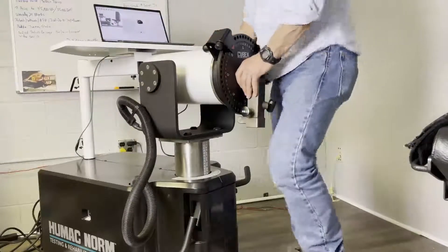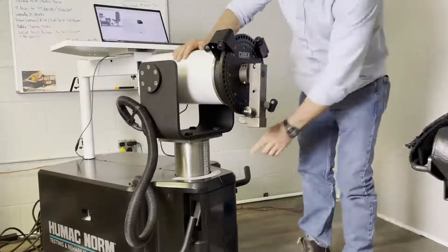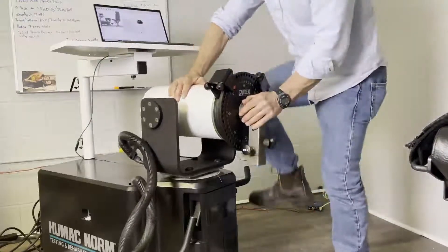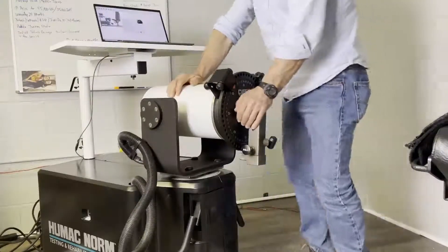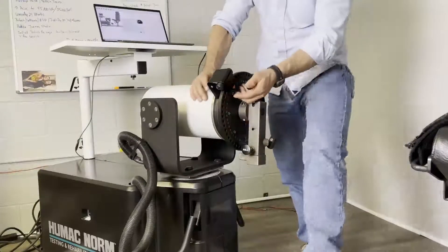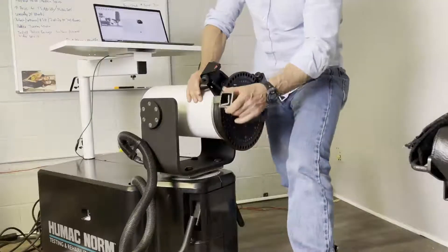Set the dynamometer rotation to zero and lock the dynamometer fully lowered. The zero is here, so I push the dynamometer all the way down and then lock it in place. Next, position the input adapter to the 12 o'clock position — you may need to open your ROM stop. Here's the input adapter; 12 o'clock is straight up.